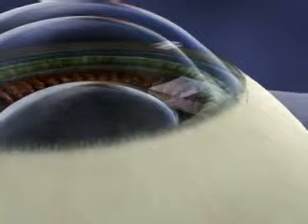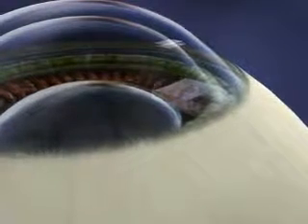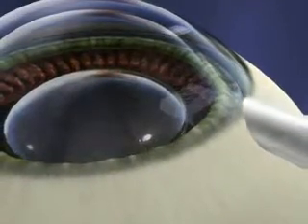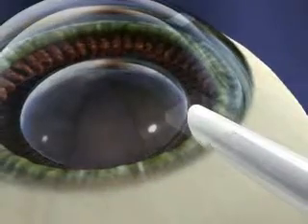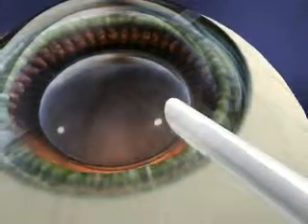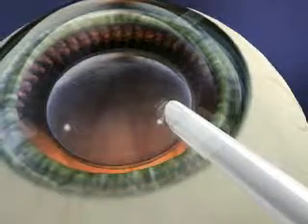The next step is the injection of the lens. Prior to surgery, your ICL was selected based on your individual prescription. The lens was folded and loaded into a small cartridge, which will now be placed through the last incision. As the lens is injected, it will gently unfold in your eye.